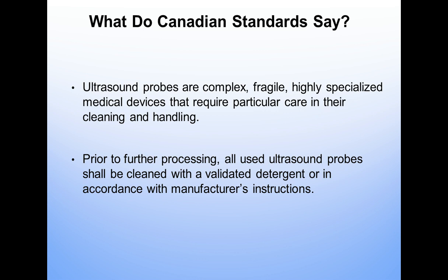So in general, what do the Canadian standards say? Ultrasound probes are complex, even though they don't have a channel, but they're still a complex device. They're very fragile, as we all know, and they're highly specialized medical devices that do require particular care in cleaning and handling. Prior to further reprocessing, all used ultrasound probes shall be cleaned. It's not a should anymore, it's a shall, so it's required, with a validated detergent or in accordance with the manufacturer's instructions.